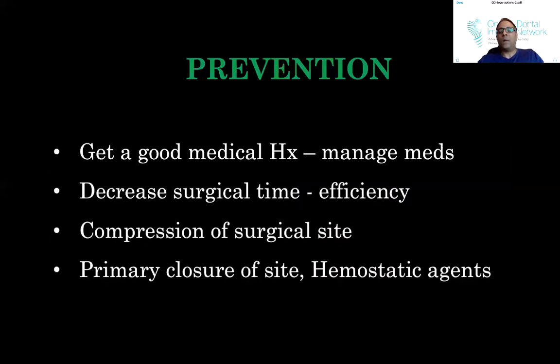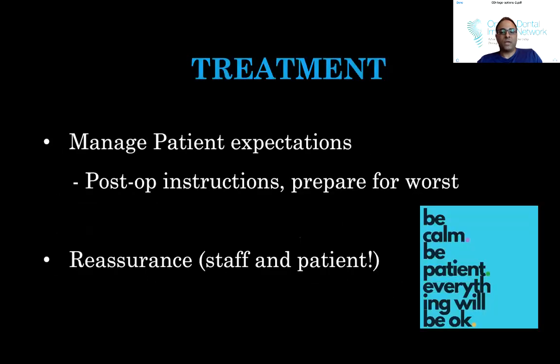So prevention is a good medical history. Okay, we want to manage their medications. We want to decrease the surgical time. And then, of course, as I mentioned, compressing the site. Try to get primary closure of your sites. I would strongly encourage you to do that. With immediate cases, how we do that is with an immediate temporary crown or a healing abutment. I avoid using cover screws if I can, unless it's a locator case. And then hemostatic agents are out there as well.